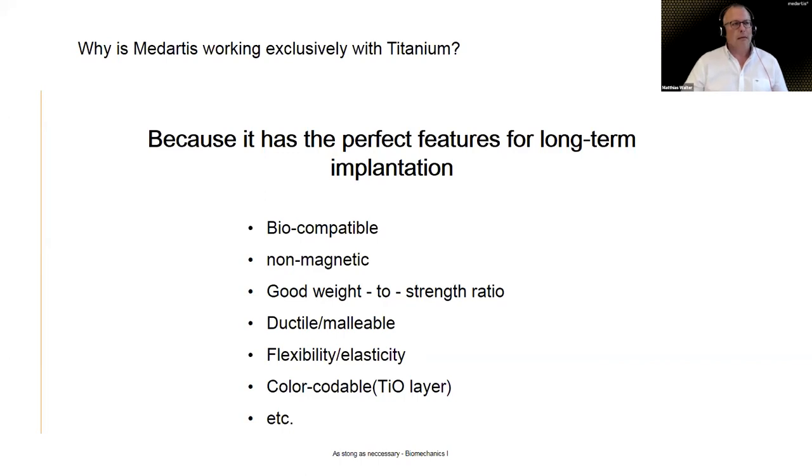Any kind of body reactions, unless, and I have to say this, unless the company has chosen maybe a wrong surface treatment. Maybe the surface is too rough and you have a bony ingrowth or something. Those things can certainly happen due to the friendliness of the metal. And the other beauty is obviously the fact that titanium is perfectly non-magnetic. So your patient is MRIable, which with a steel implant is not that easy.